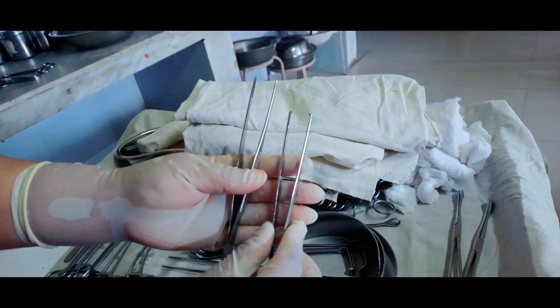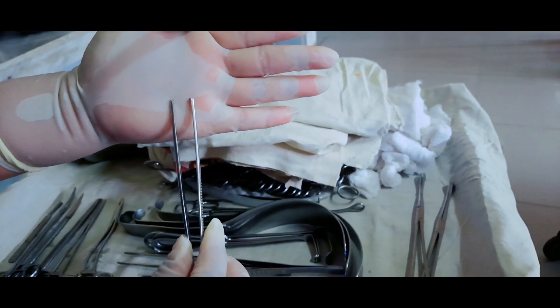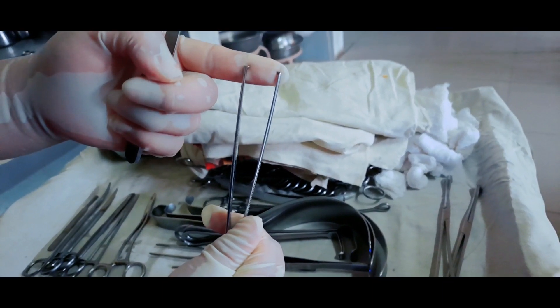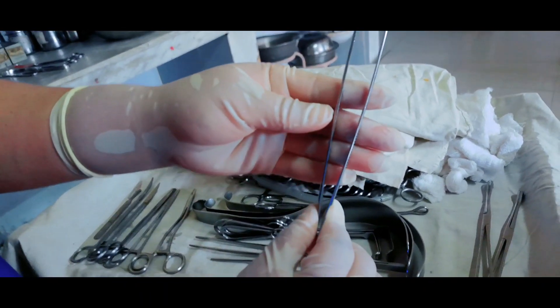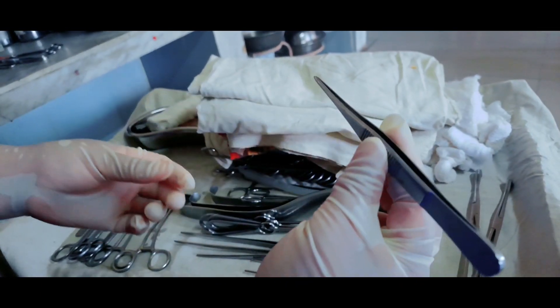Two thumb forceps. One forceps has a tooth at the end, known as toothed forceps, mainly used while stitching to hold muscles and harder tissues, especially while giving a stitch. The other thumb forceps is plain and is used while giving a stitch to hold soft tissues.